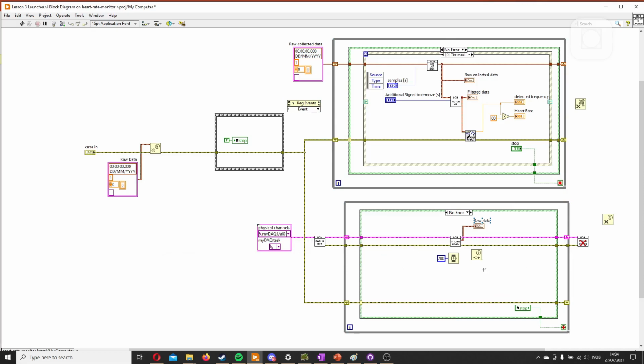Let's start with the sending, as it's easier. We'll just remove this one here, and we will connect this one to the error wire. And then we can connect it here. So now this one knows that it will send raw data. So if I put in something like the millisecond here, we will see an error. But if I put in this waveform, there is no error.